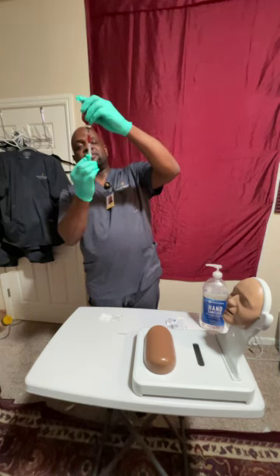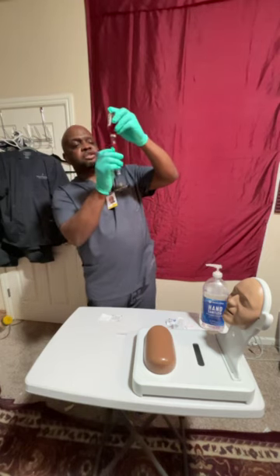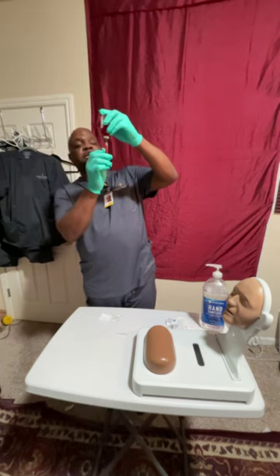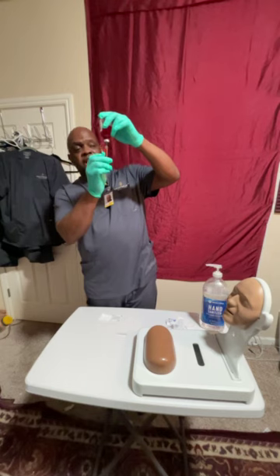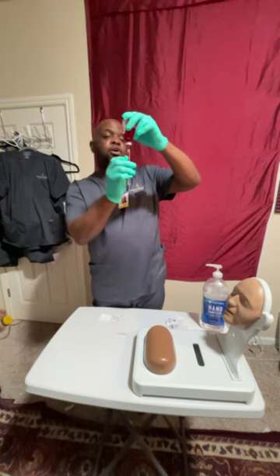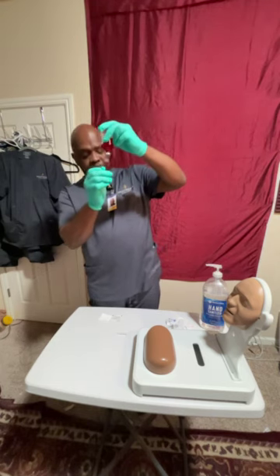So 1.5 mLs. Now from there, I'm going to tap on the syringe, making sure there are no air bubbles. Luckily for me, there are no air bubbles on this. Because this is not a medication that I have to mix, if there were air bubbles, or too many, it would be okay to actually push it all back into the bottle and then withdraw, but that's not the issue here, right? So I'm going to remove that there.